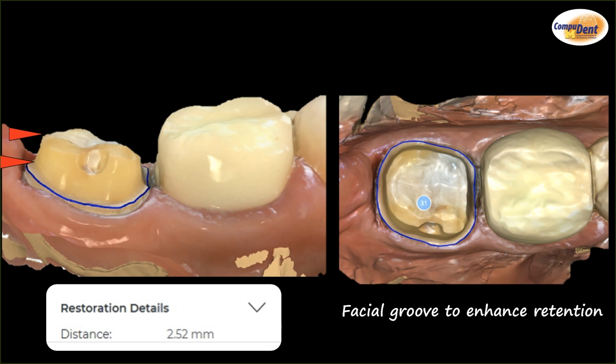Well, something we talked about, and you can see here on the facial, enhance your retention with a groove. Now, in this case, this groove is only going to help mesial distally. And the discussion must have been, well, look, the facial and lingual look like they've got pretty good walls. Those will be retentive. Let's put the groove there so it doesn't rock mesial distally. Again, optimally, I would do that on the facial or lingual and the mesial or distal. So you have them at 90 degrees opposing each other, which would significantly shorten the radius that crown could come off that tooth.